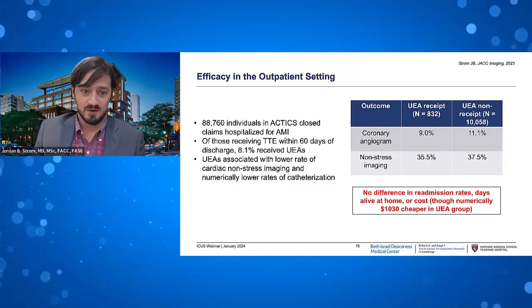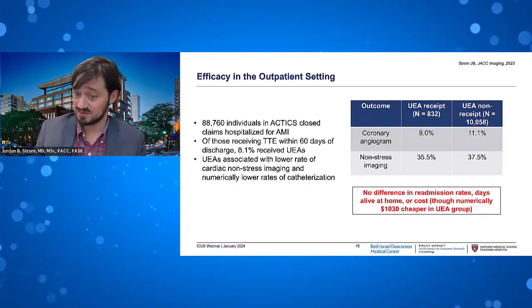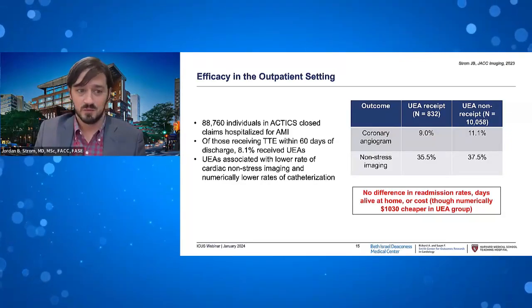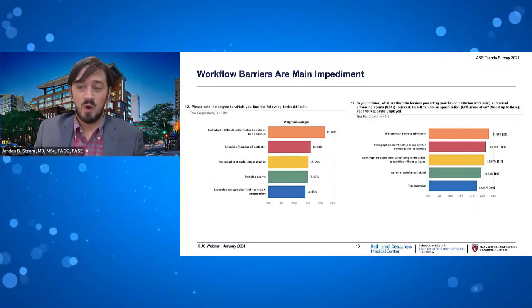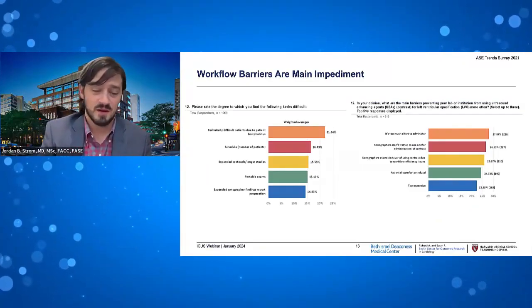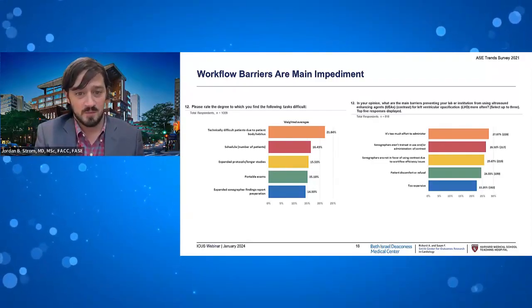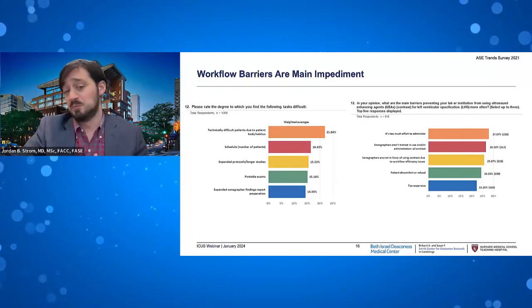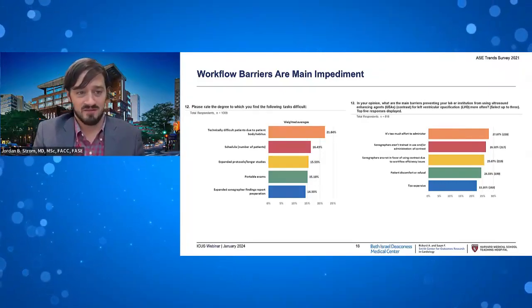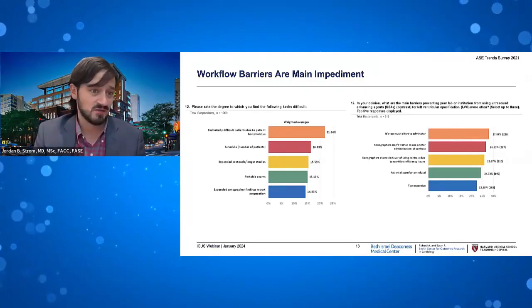And so we see this as a sort of good indication that certainly there's not a massive excess risk, but ultimately there seems to be some benefits associated with receiving contrast. So why aren't we using contrast? And so I'll call your attention to this survey. ASE, the American Society of Echocardiography, produces a survey every year that's sent out to not just ASE members, but the echo community writ large, asking them about a variety of different things related to the field. And it's a great way to capture trends within the field.